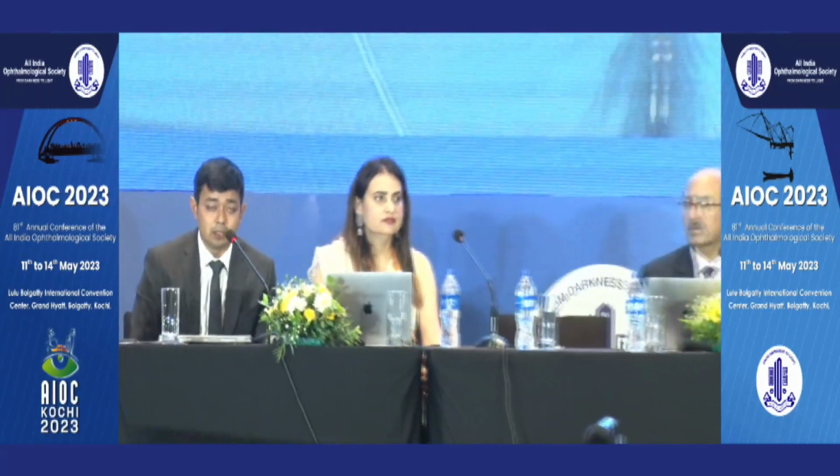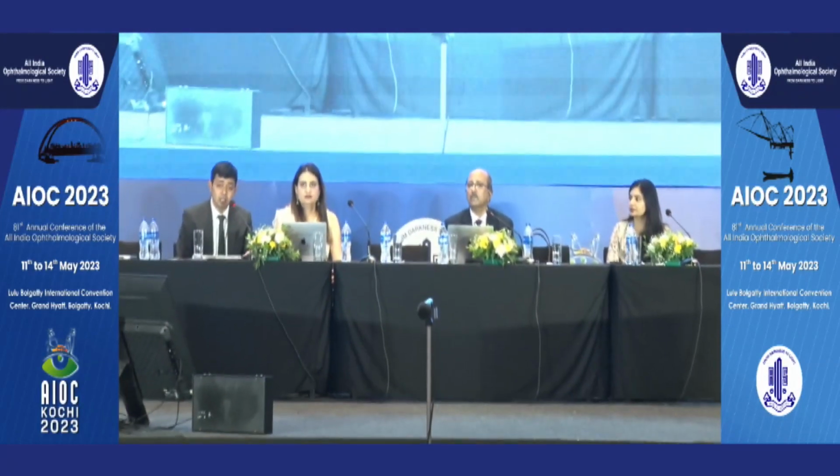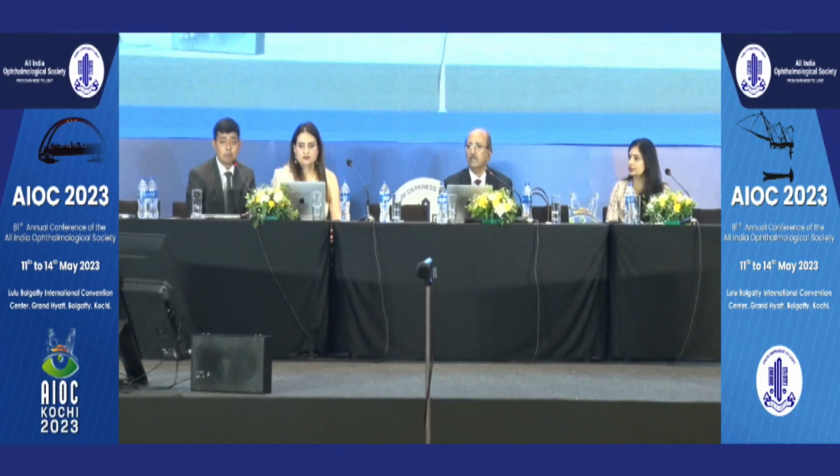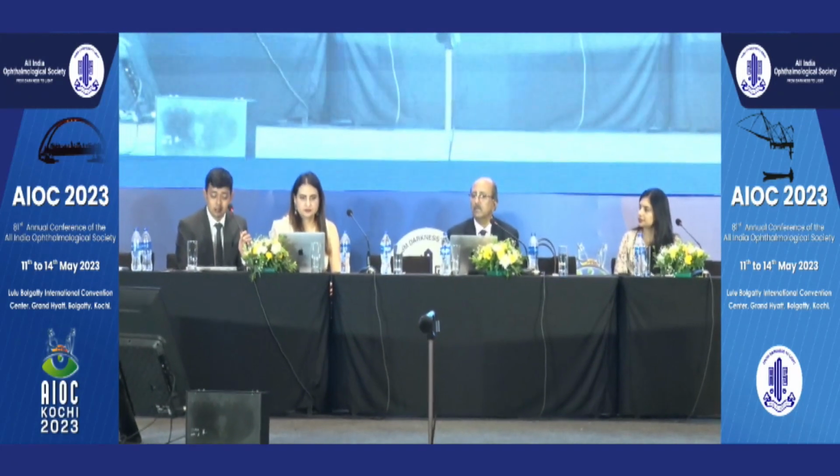We have almost stopped even looking at the ASCRS or other calculators nowadays, and the Barrett True K, and if you have the TK with you, the Barrett True K TK works even better, and we are able to achieve excellent results with them. You are even able to have the confidence to implant multifocal IOLs in many of these patients because the biometry is spot on.